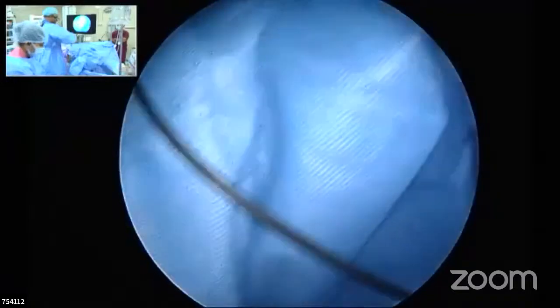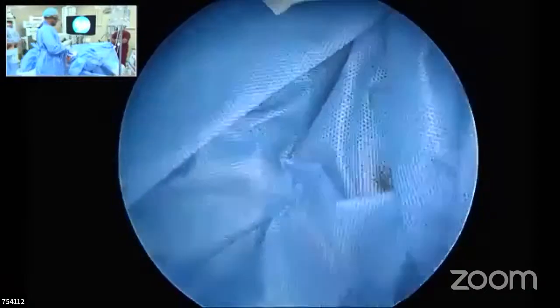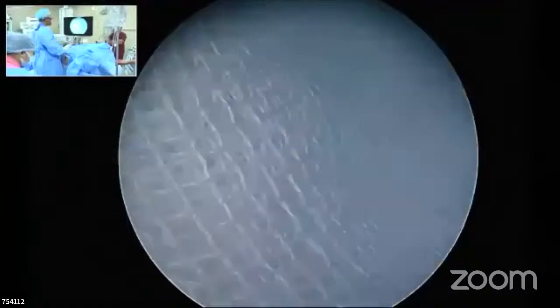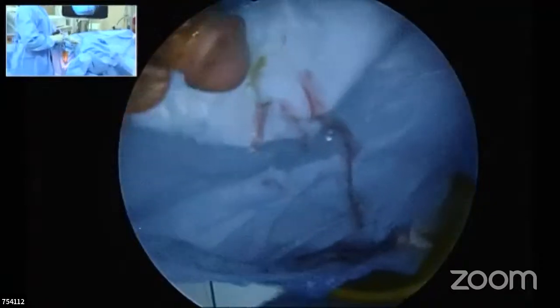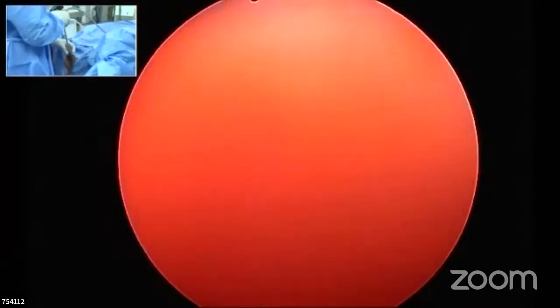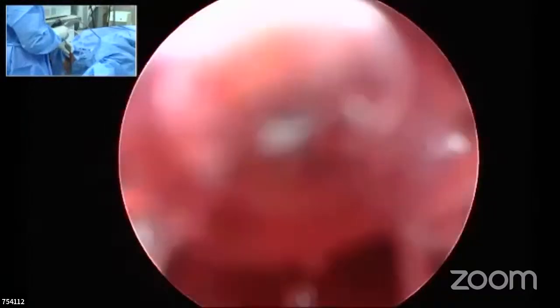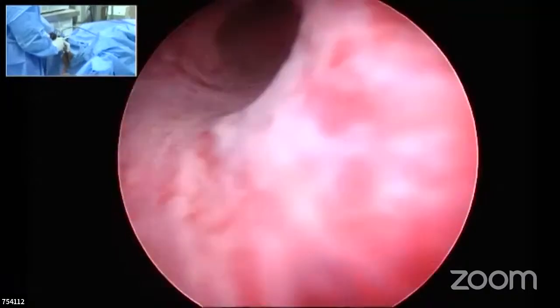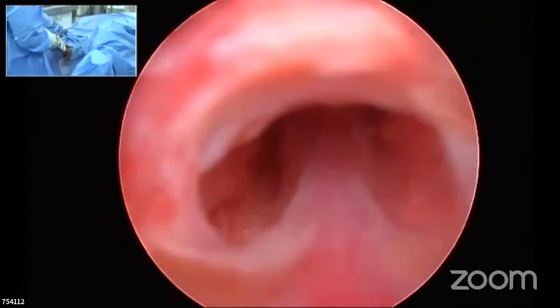Once upon a time, if you remember, Gupta sir, 30 years ago, every patient before TURP used to come for a minor OT and used to be calibrated, because we were missing stricture urethra and taking the patients for TURP. Surprisingly, we used to find a stricture on the table. So instead of a preoperative calibration, we are now doing a peroperative cystoscopy to look for a stricture, which we should not be missing when we do a resection. Am I right, sir? Yeah, I agree with you.